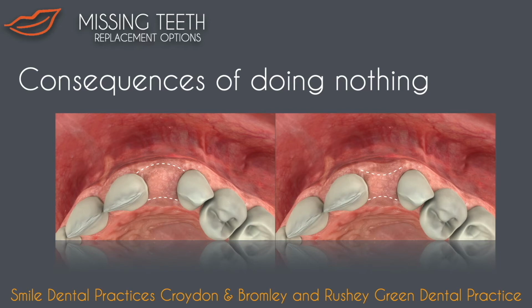An implant will exert pressure onto the bone and stimulate and preserve the bone. By doing nothing, you will not only lose the bone in a horizontal dimension, as shown here on the photograph, you will also lose bone in the vertical dimension.